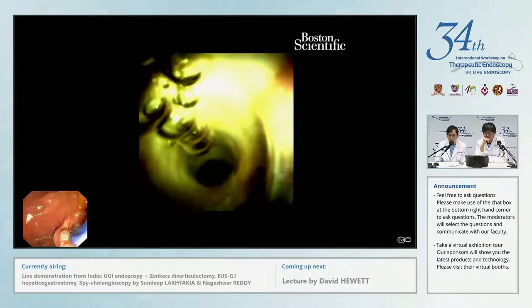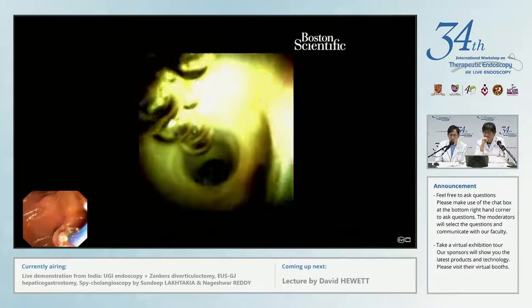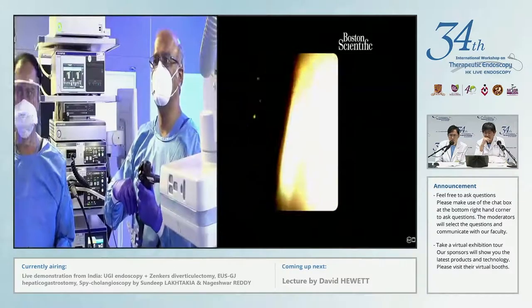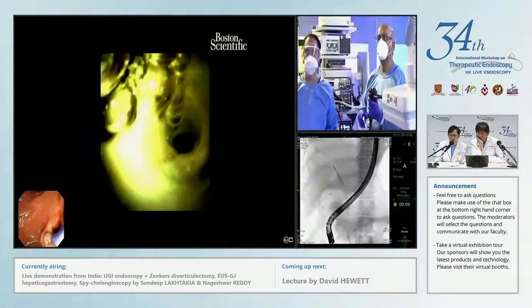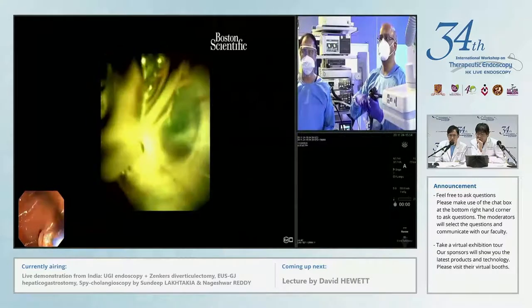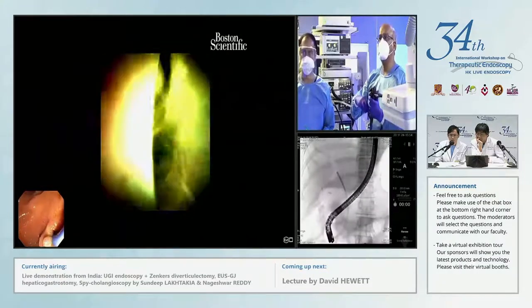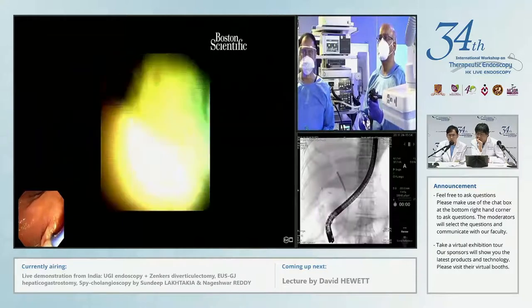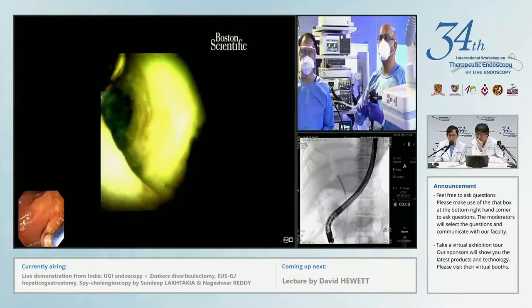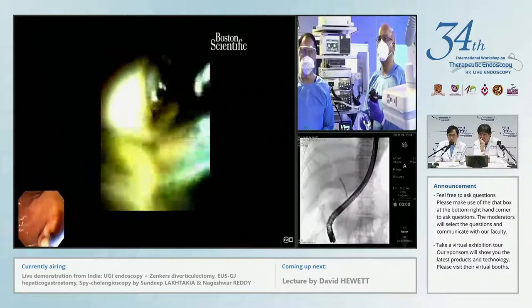If you see the air cholangiogram also here, you'll see that I'm seeing the intrahepatic ducts. I don't know whether you're getting the air cholangiogram, but we can see it fairly nicely here. Okay, yeah. Now you can see. Yes. Now I'm seeing the ducts nicely, and you can see the air cholangiogram. I'm somewhere in the mid part here. And again, very important to frequently put it so that it's in the center of the field and gradually start pulling it out. And then now I can see that there's some greenish muck there. And this is where I'm coming to the hilar region. You can see in the air cholangiogram also that we're in the hilar region. And I come back down here.